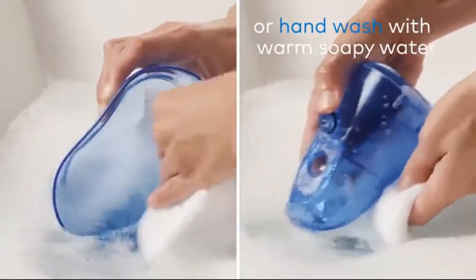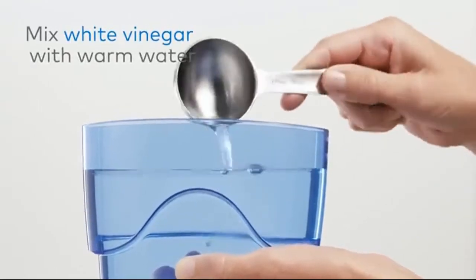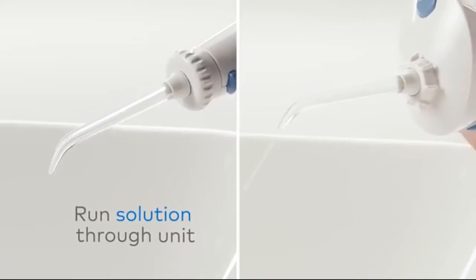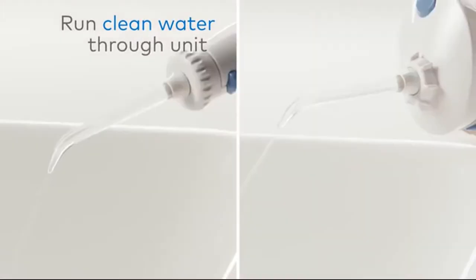Reservoirs can also be hand washed with warm soapy water. Tip number three: clean the internal parts. Based on your model, mix one to two tablespoons of white vinegar with a full reservoir of warm water and run it through the unit until the reservoir is empty. When complete, run a full reservoir of clean warm water through the unit.